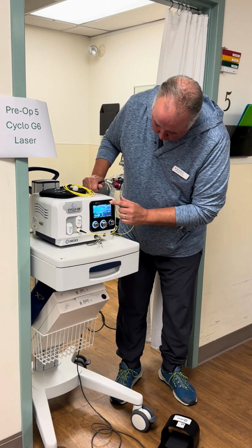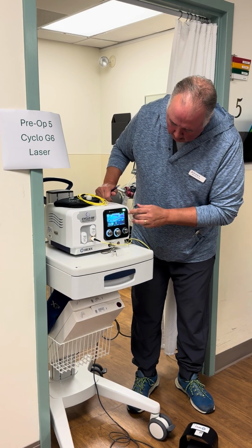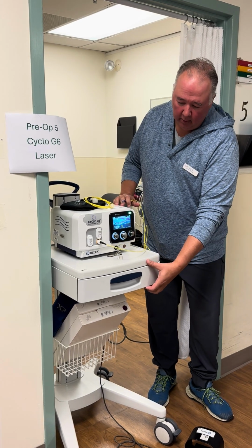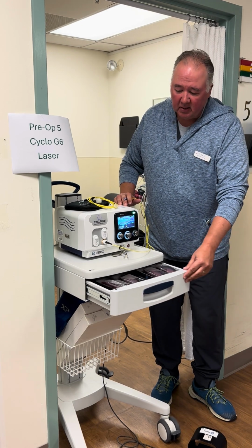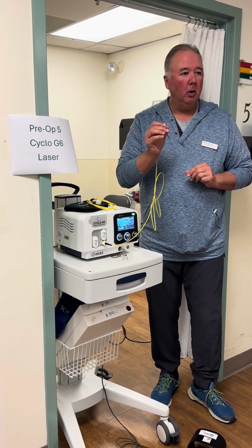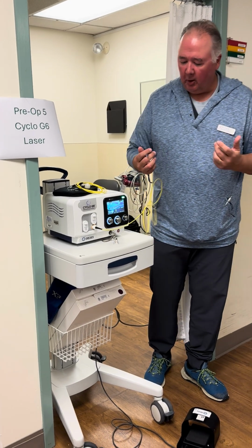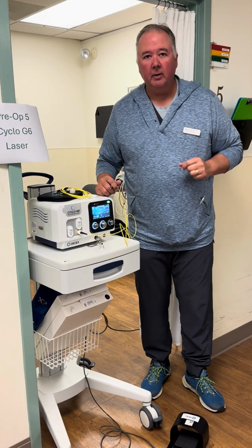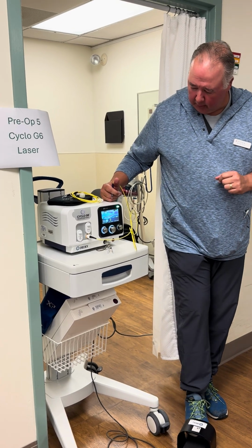When you hit the green button to go, that's basically arming the laser. Should all have your safety glasses. Whoever's on in the room should have these on. The beam itself is only coming out maybe a millimeter or 2 out of this probe. So if you're standing on the other side of the room and you forgot to wear the glasses, chances are you're safe. So it's more of a safety precaution, but nevertheless, it's better to be safe than sorry and have the glasses there.